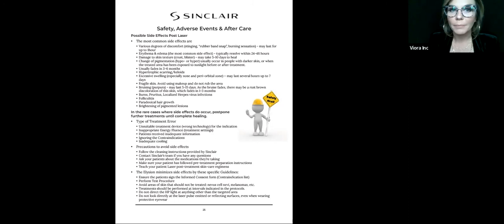It's things like that that will resolve, but it's good to know, because when you're talking to your patient in a consultation and letting them know what the risks are, what's normal, what to expect, what they'll see, all of that's really important. So I just highly recommend reading through this. All I would be doing is just reading through it to you, and you can do that yourself.